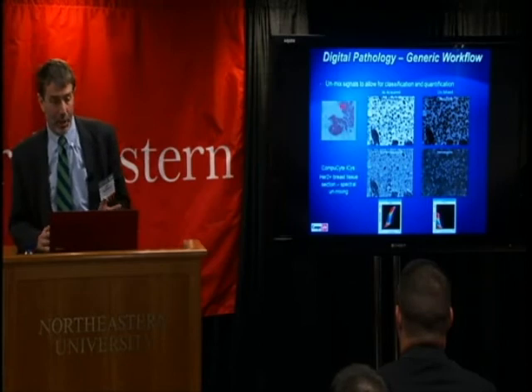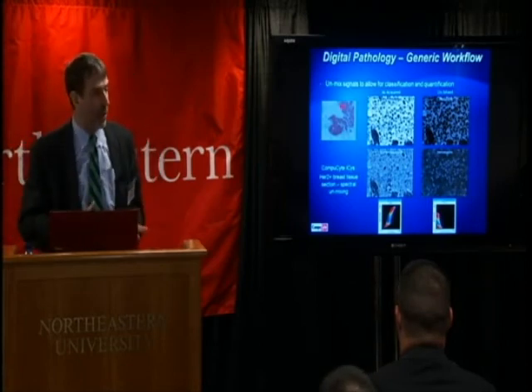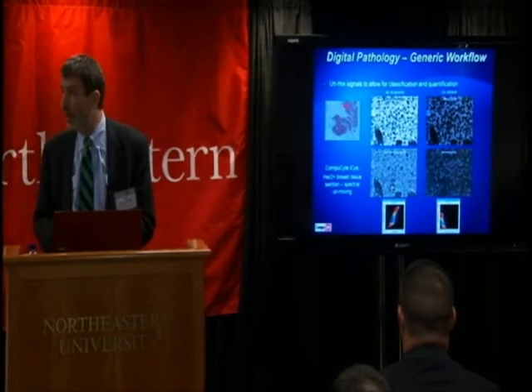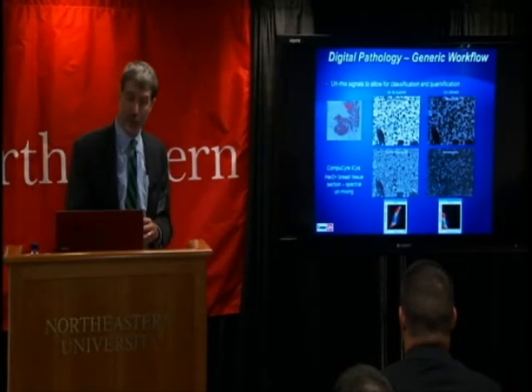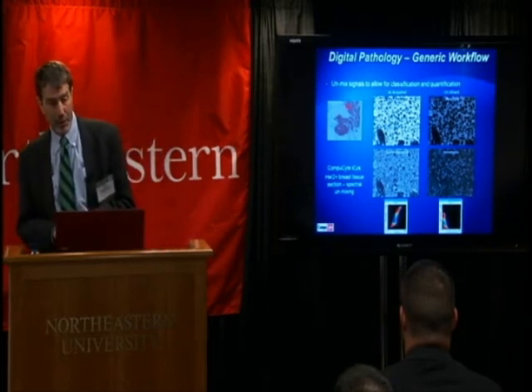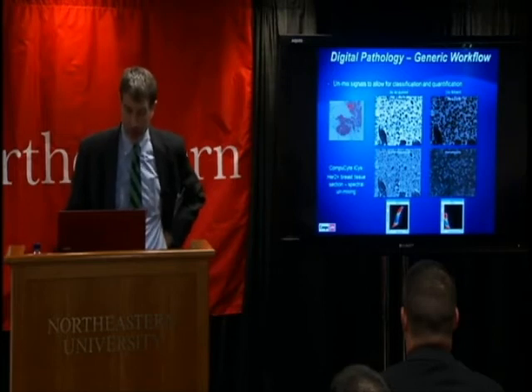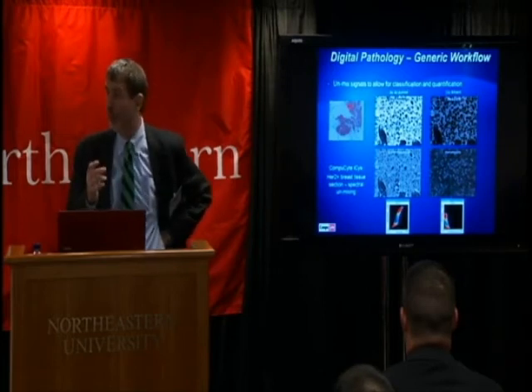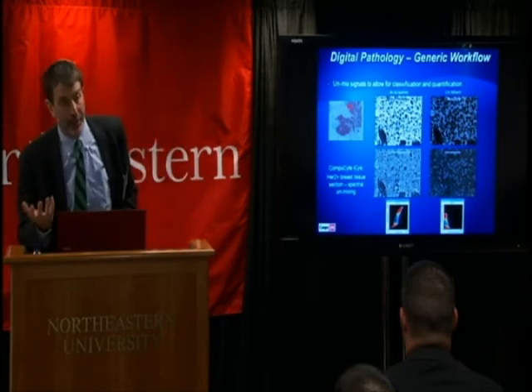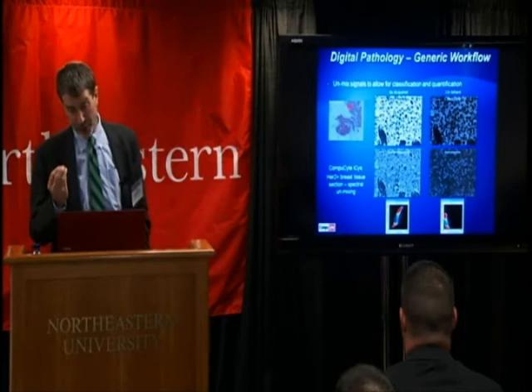Then the unmixing issue that Badri touched on also has to happen in order to really quantify molecular players. Here is a similar example to what Badri showed. This is a HER2-positive breast cancer tissue section, human breast tissue, stained with HER2 developed with the chromogenic stain DAB, and then counterstained with a blue stain, hematoxylin, that stains the nuclei.